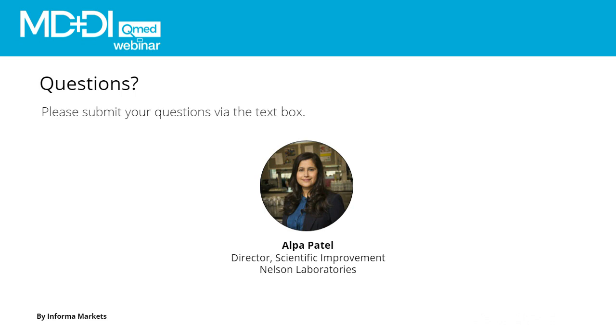The only caveat here is, there is no one detergent that's used. When you do these end-of-life use tests, we're using a detergent that's commonly used. However, you go to Germany, it might be something different. You go to Australia, it might be something different. You go to Africa, it might be something different. So to try to assess all these different chemistries that you're using, you don't know.